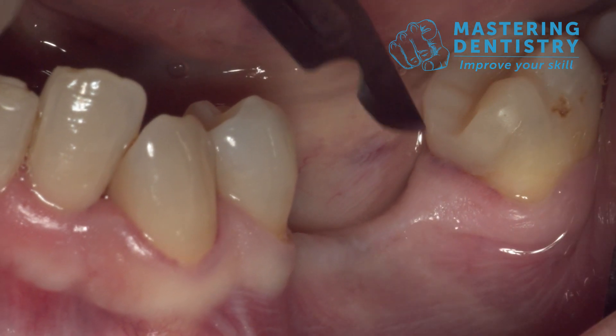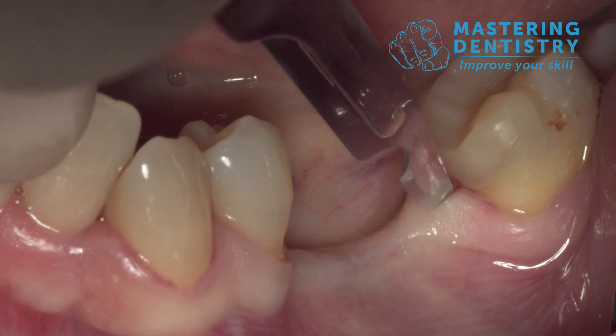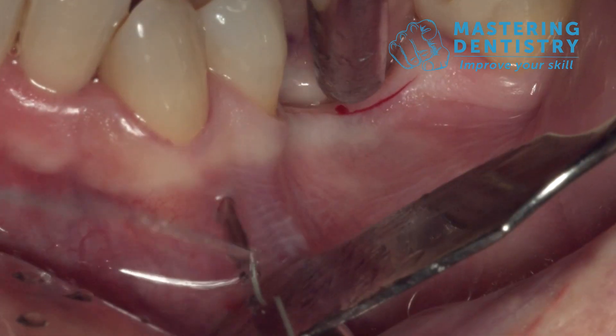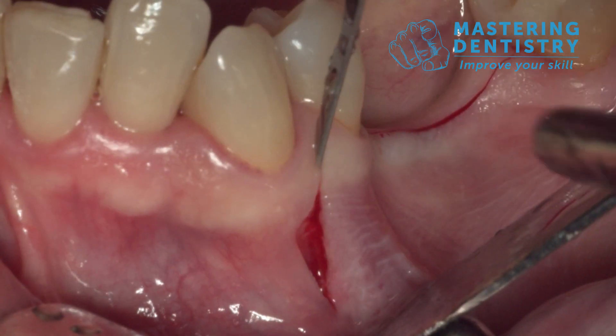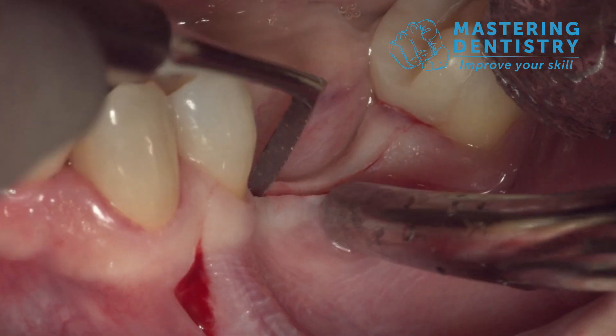The first step to expose and protect the mental nerve is to raise a full thickness flap. We start with a full thickness incision in the middle of the ridge, and then we go with a vertical incision — a deep vertical incision — because in this case the mental nerve is very deep, very apical, so we need a big flap.